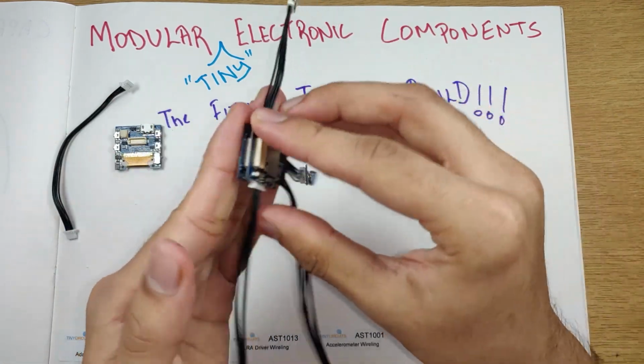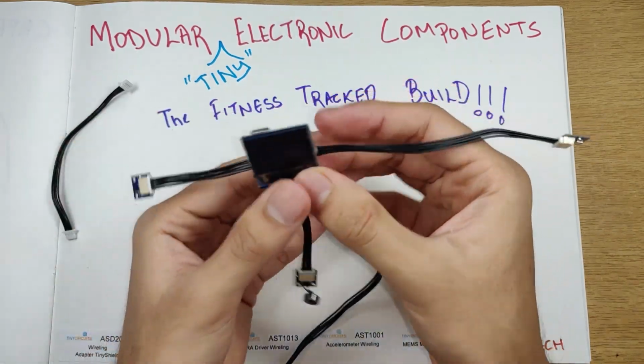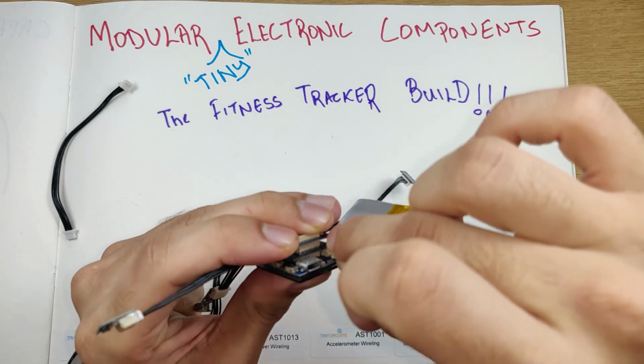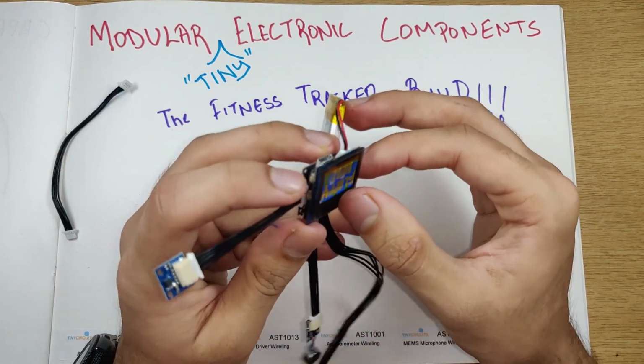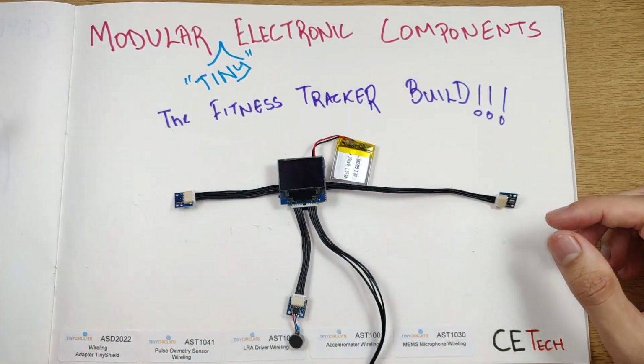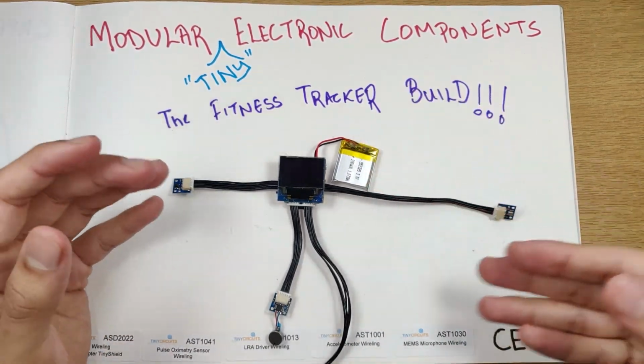So assembling the stack back again, and there we have it. So we can connect the battery as well, and there it goes like that. We'll switch it off right now because it's in Flappy Bird mode, which we don't want to play right now. That's it. That's all connected.